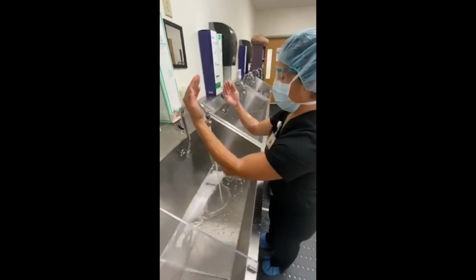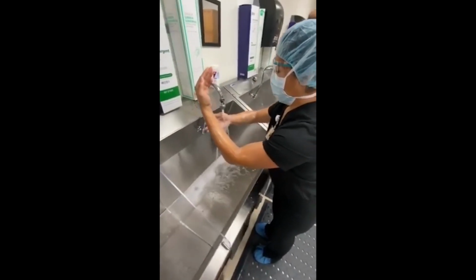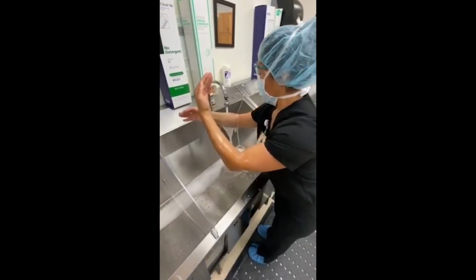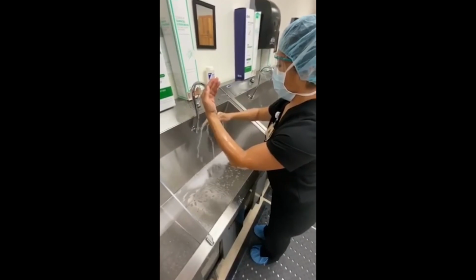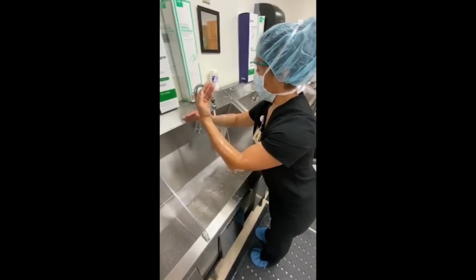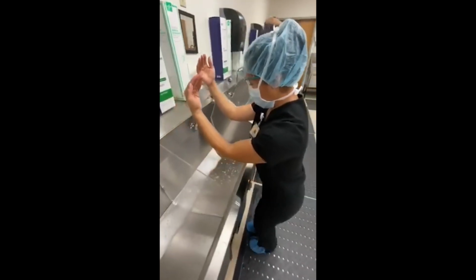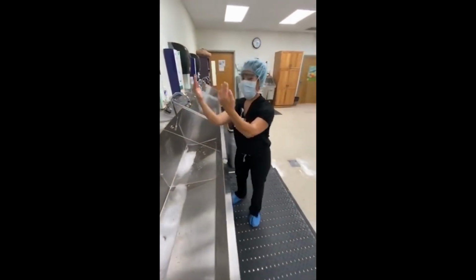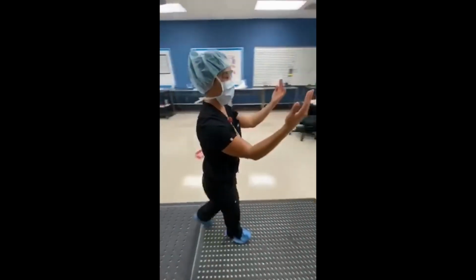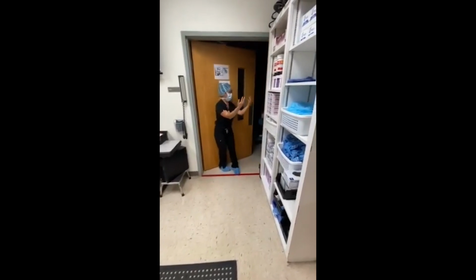And you can do multiple runs through. Again, be mindful as you're doing this that the opposite arm does stay up, fingers to the ceiling, so that the dirty water does not fall from your fingers. Instead, we want it dripping from your elbow. She turns off the water with her knee and for just a few seconds stands there over the sink to let all the water drip, proceeds to walk to the OR, turns, and pushes the door with her back.